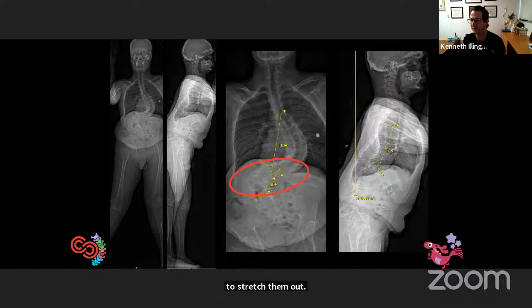He's completely backwards. He's got cervical kyphosis, he's got 54 degrees of thoracic lordosis, and he's got lumbar kyphosis, and he's got significant sagittal imbalance. I mean, this sagittal profile, for somebody who doesn't deal a lot with adult sagittal profile deformities, is a real challenge. And so mostly because of his sagittal profile, again, we decided to proceed with traction.